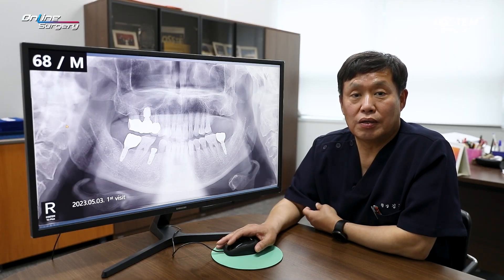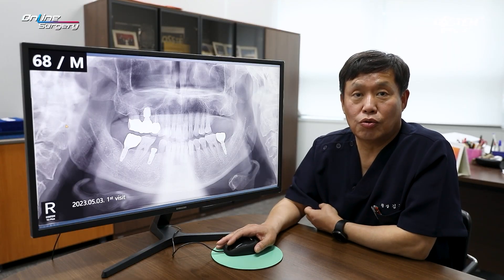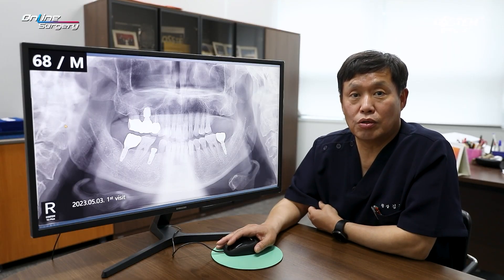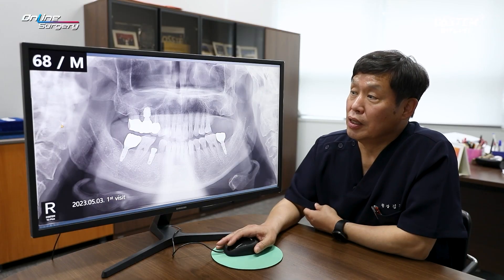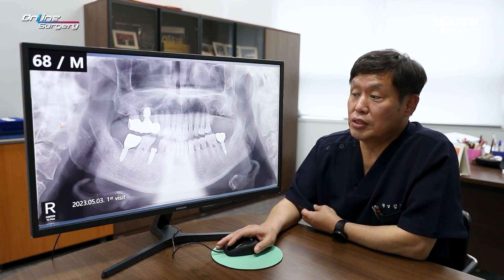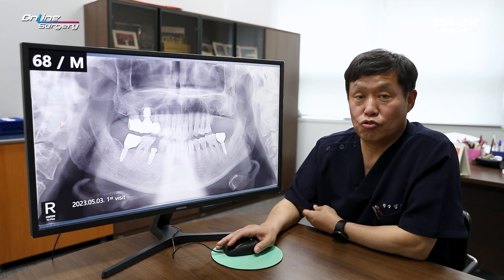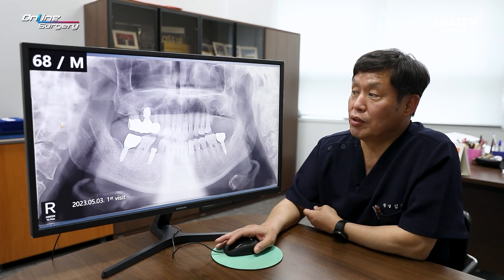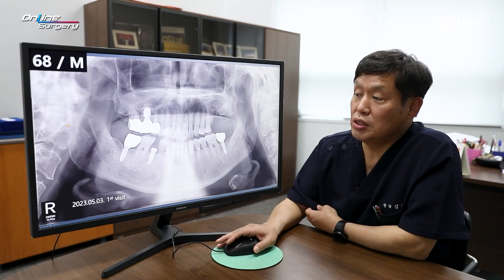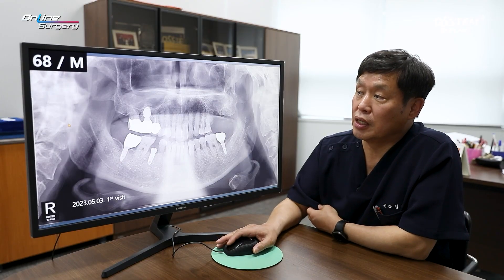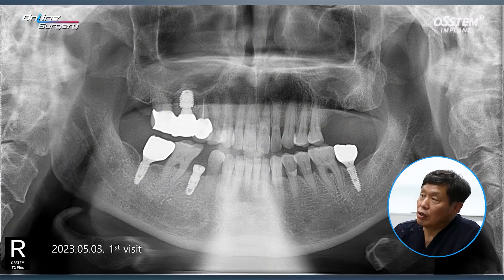Hello, this is Gyeong-won Kim. It's a pleasure to meet you all through this online surgery session. Today's patient is a 68-year-old male. As you can see here, this is the panoramic X-ray from the patient's initial visit.